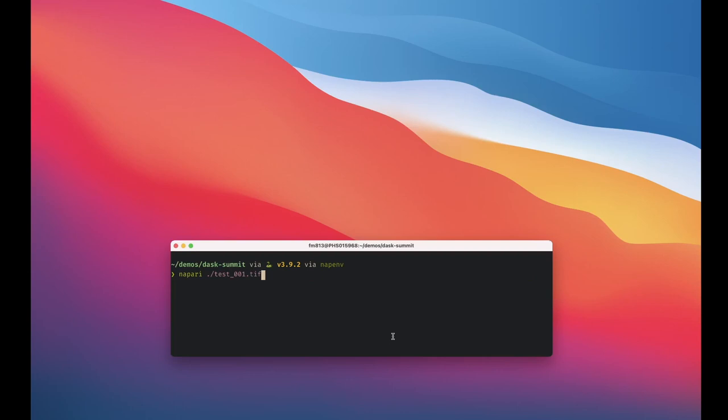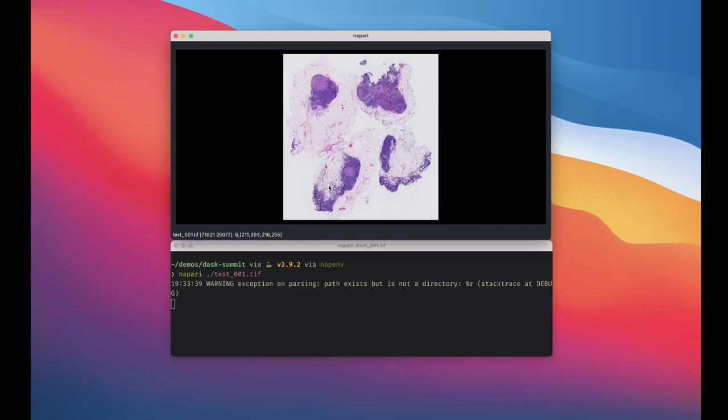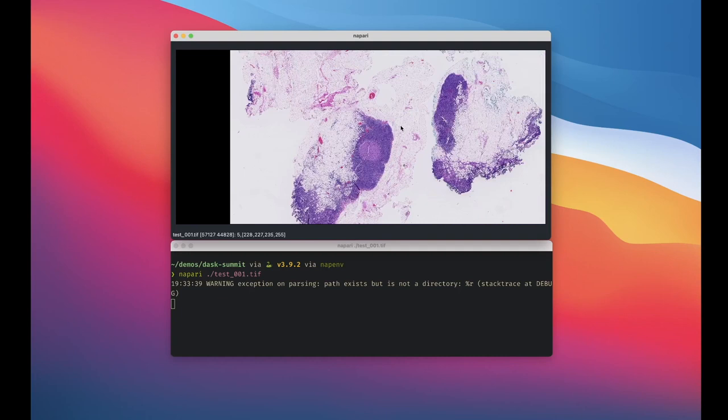Here I have an image installed locally, which is a whole slide image, and I'll open it with the Napari Lazy OpenSlide plugin. This has created the OpenSlide store, which ultimately powers this interactive view with the Dask arrays on top.